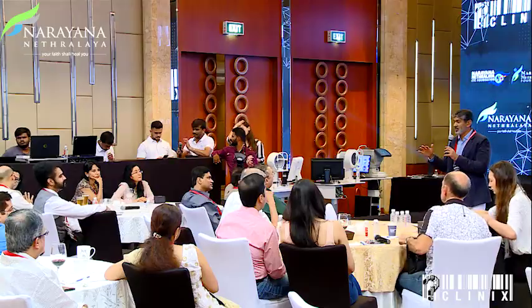Now I do even 2.6. At 2.6, you have to be very intelligent in your selection of the lens, because the tolerance is very small. The margin for error is very small. So ideally 3.2, and then with time, as you're doing more cases, 3 millimeters. 3 millimeters is a kind of cutoff. As you become more experienced, you do 1,000, then 2.8. You do 5,000, then I think Shimizu's cutoff is 2.5.